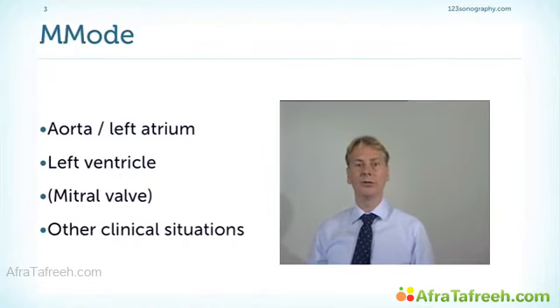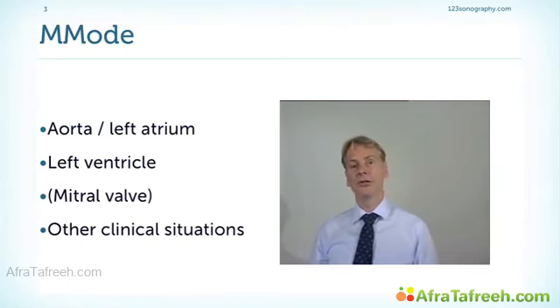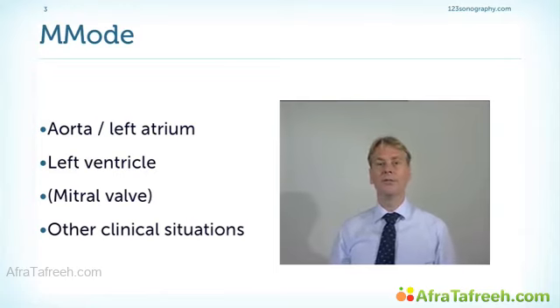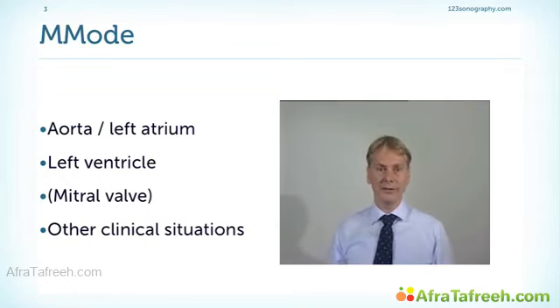First of all, it's important to look at measurements of the aorta and the left atrium. You can also look at the mitral valve with the help of M mode. And in particular, it's also good to measure the left ventricle. The size and the function can be assessed very nicely with M mode.